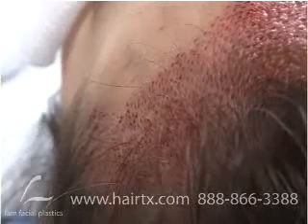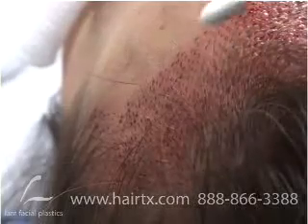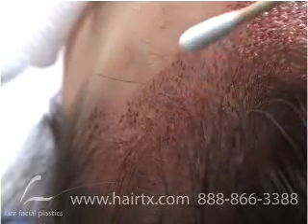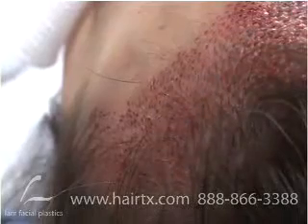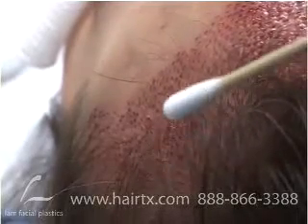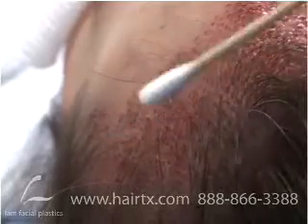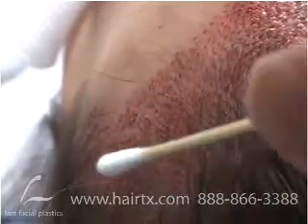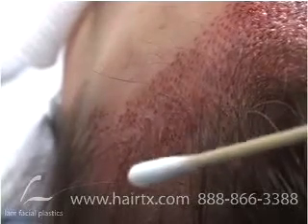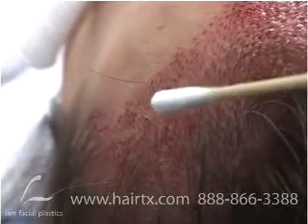We are finally at the left side of the hairline, and what I want to show you is completely different from the other. Remember I said earlier that we don't want to go anteriorly, but there's always a point of turn where the cowlick starts to move in this direction. So you can see these are actually facing anteriorly because you have to transition from the cowlick going to the side to going forward and then sweeping to the left on this side. So it's actually sweeping downward. That transition has about 3 or 4 rows of hairs that do move anteriorly, but almost everything else follows in a posterior or horizontal direction right here where the split occurs.